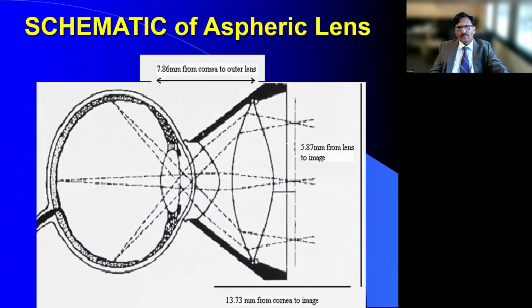And this is a higher close-up, so in terms of the distances, where is this image forming? And as you can see here, this lens is basically attached to the cornea. So you're basically 7.8 or 8 millimeters where this 150 diopter lens is placed. Remember, the focal length of this 150 diopter has to be conjugal to the nodal point for you to be able to get a good stereoptic image with great resolution.